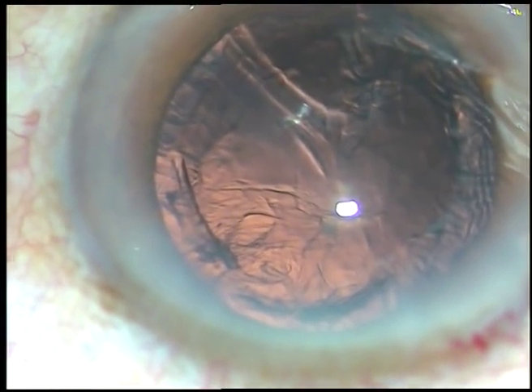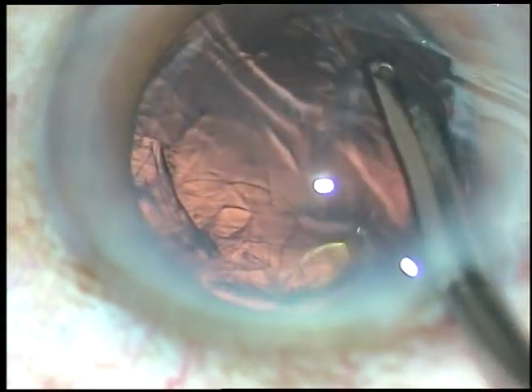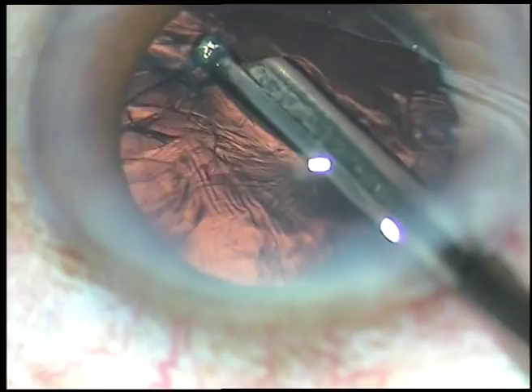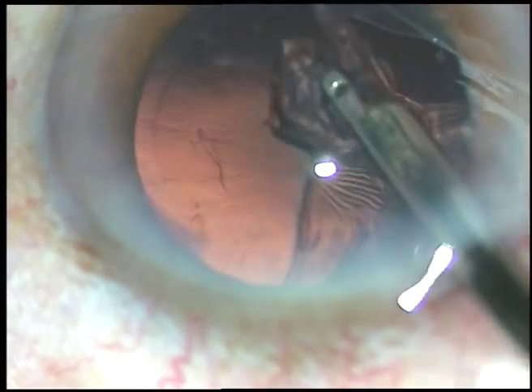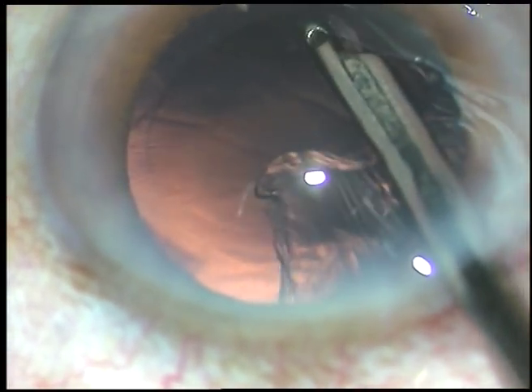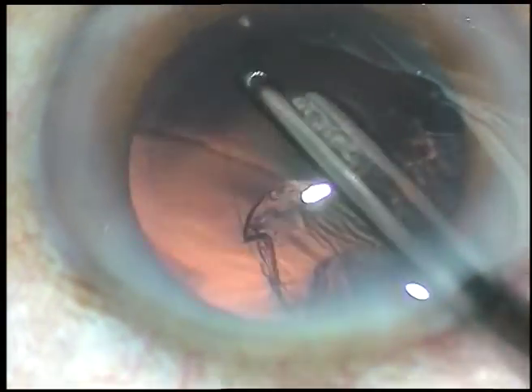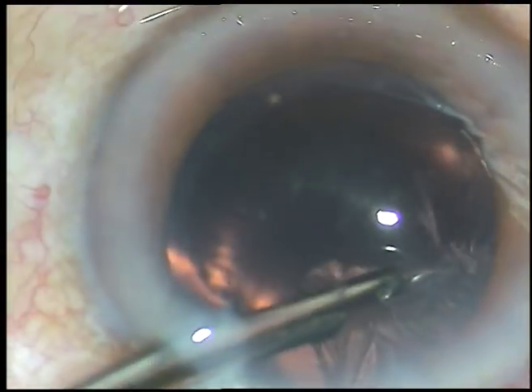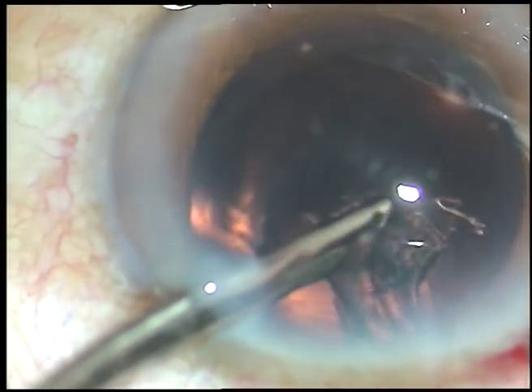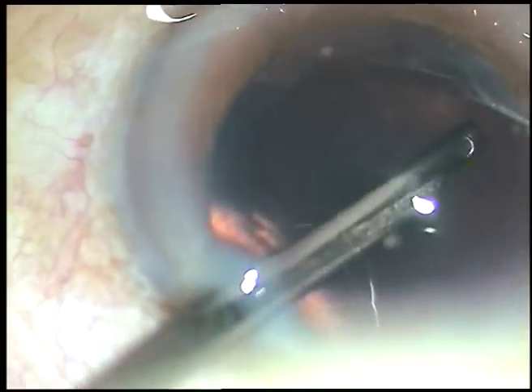You can clean the cortex in several ways — bimanual irrigation aspiration, coaxial irrigation aspiration, or this very simple instrument: a 23-gauge direct Simcoe cannula. I have made only one side port because I am not going to use bimanual irrigation aspiration in this case. So although the side port is about 1.4 to 1.6 mm, you are making only one side port. The cortex is cleaned and the posterior capsule looks very clean.